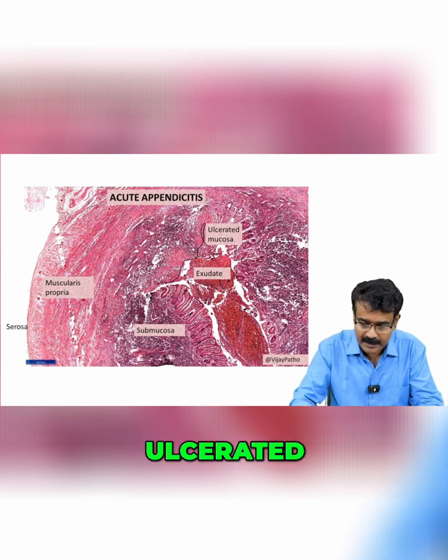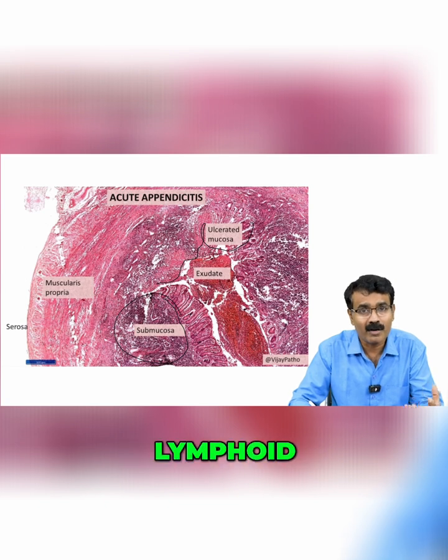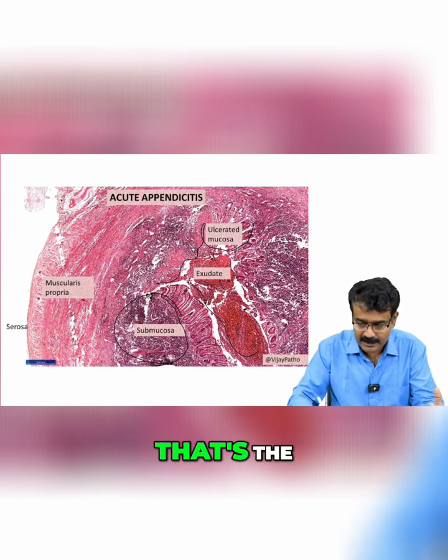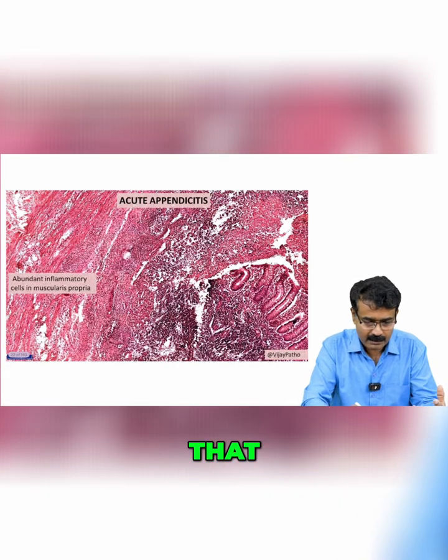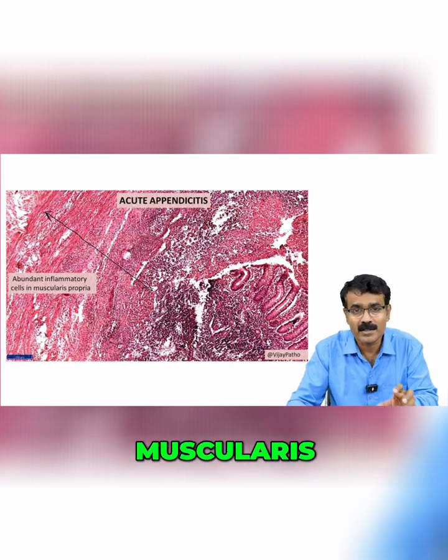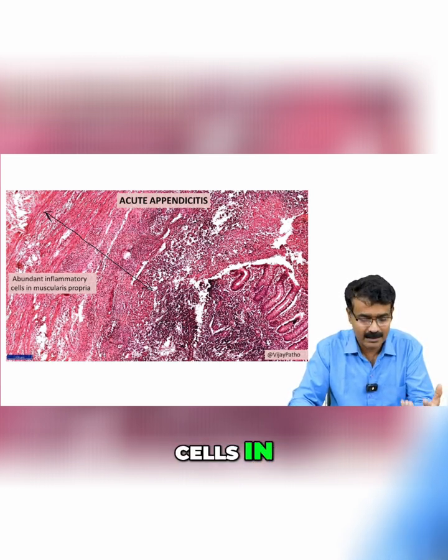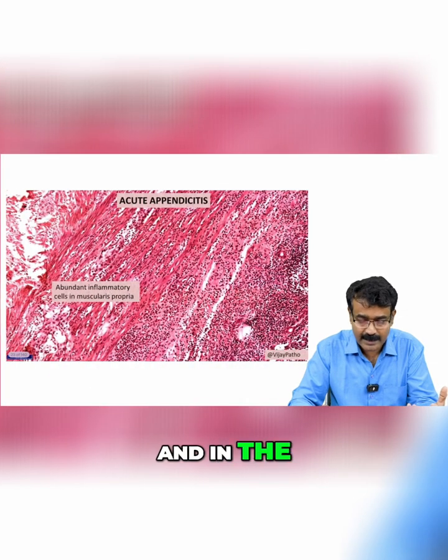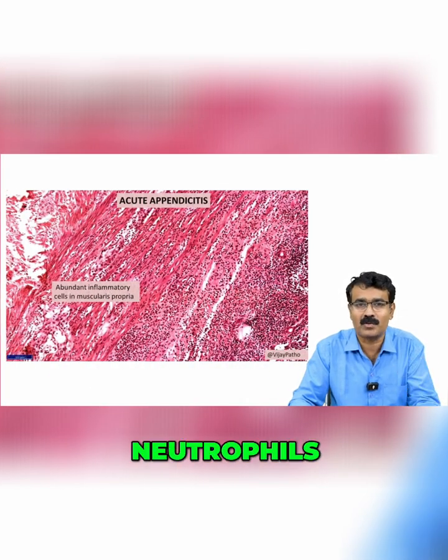That is the ulcerated mucosa. This is the submucosa where you find lymphoid follicles normally; that is the exudate in the lumen. You can see abundant inflammatory cells — at this magnification you can see those tiny little dots in the muscularis externa. These tiny little dots are inflammatory cells in the muscularis propria, and in the higher magnification you can easily make out that these are actually neutrophils.